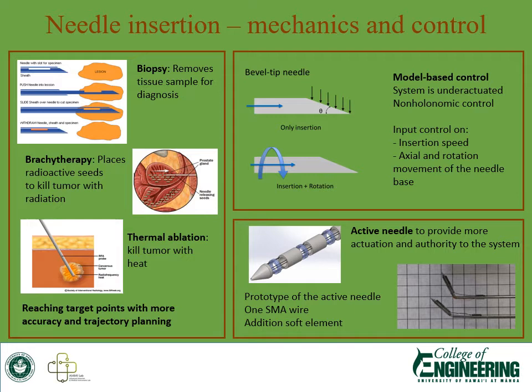Needle insertion has been used in many therapeutic and diagnostic procedures. It has been used for biopsy to diagnose cancer via biopsy samples. It has been used in brachytherapy and thermal ablation to kill the cancer locally. The purpose of needle insertion procedures has been to reach the target more accurately, and also in many cases surgeons need to follow a desired trajectory to reach the target.